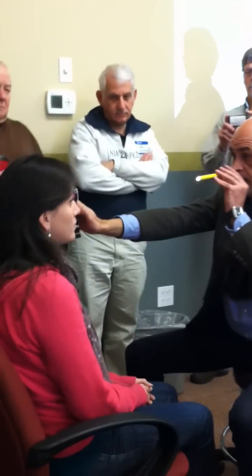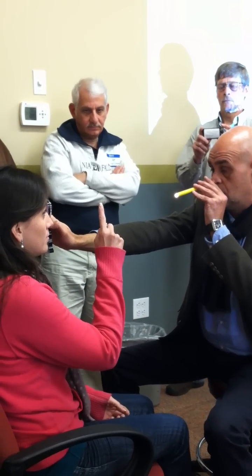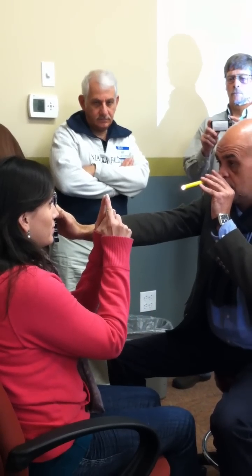She's overcompensating. Can you touch with your right hand where the line is? Touch it. And now with your left hand. And now with both hands.